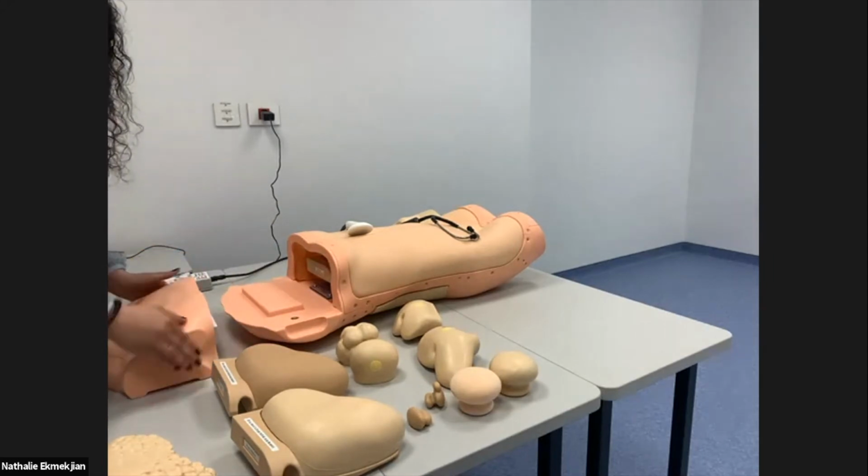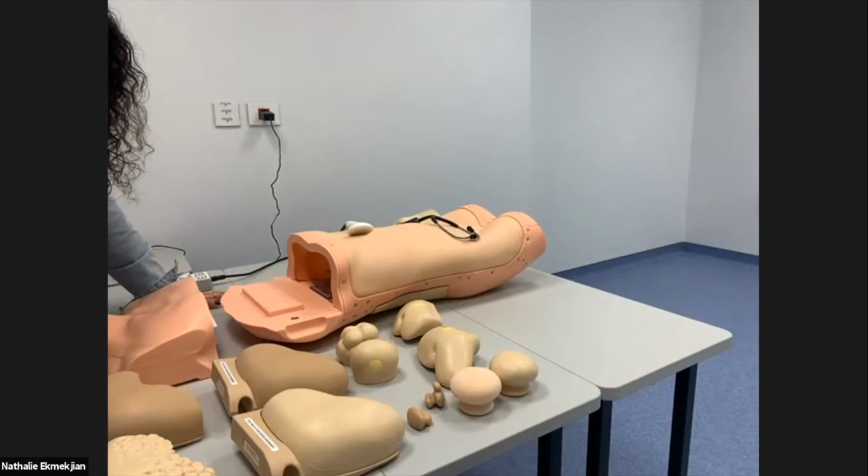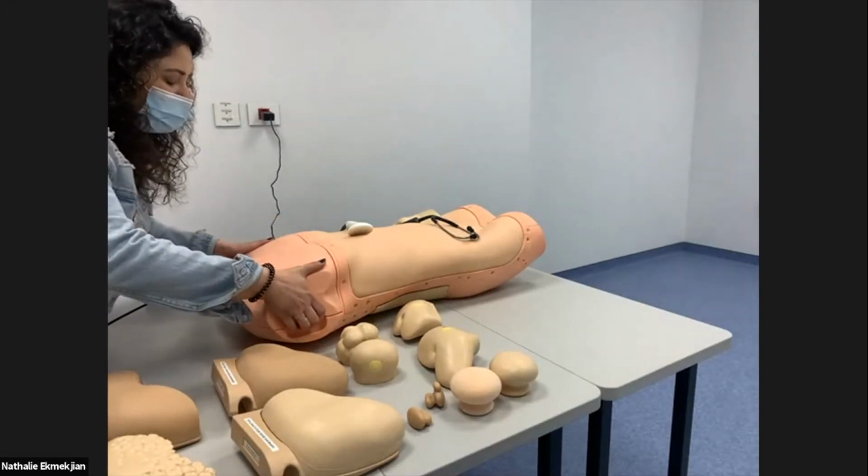The same thing will be applied with other interchangeable organs for the liver. So if we put one of them. So this part is for the liver.